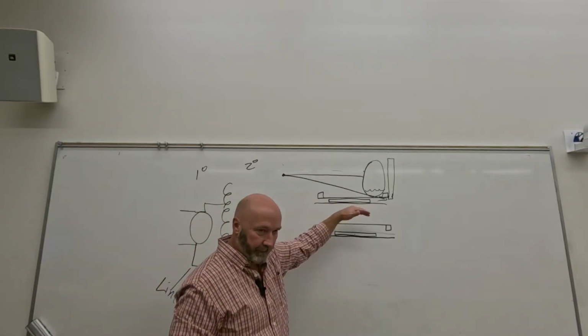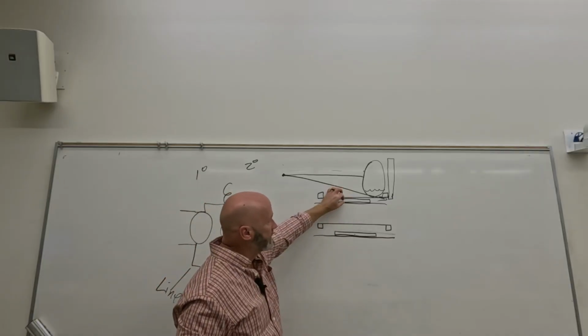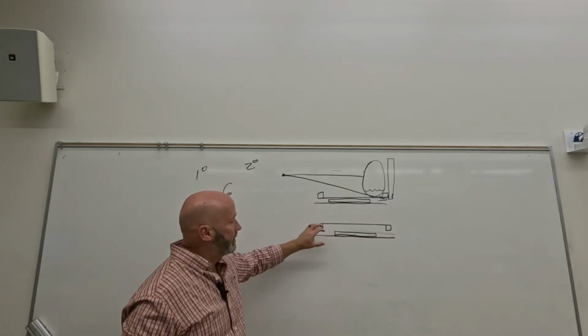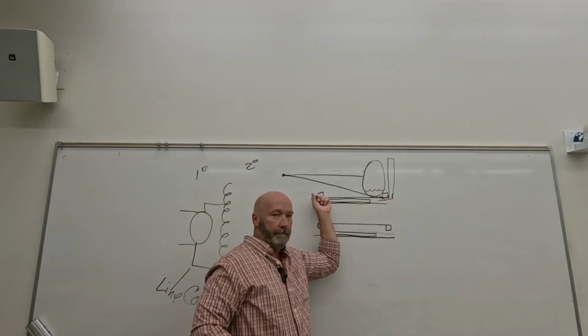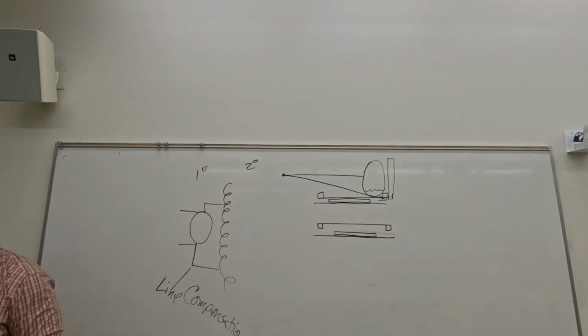So it has to be radiolucent and of uniform thickness. The benefit to this is that it decreases OID, right? The benefit to the other is you don't have a problem with your cross-table laterals and things like that, the support system getting in the way. You have less of a problem with it anyway. All right, so you've got those things.